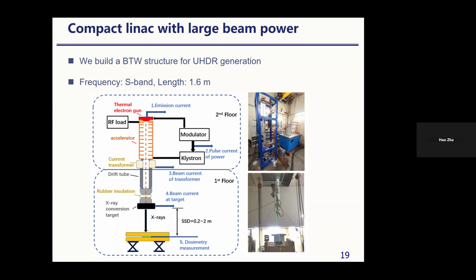Of course, this is not ideal for therapy because the resulting field size is very large. But we showed that conventional linear accelerators can achieve a sufficiently high X-ray dose rate, at least meeting the flash radiotherapy standards. This gives us the confidence to move forward.